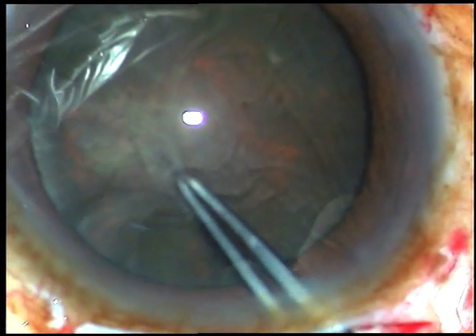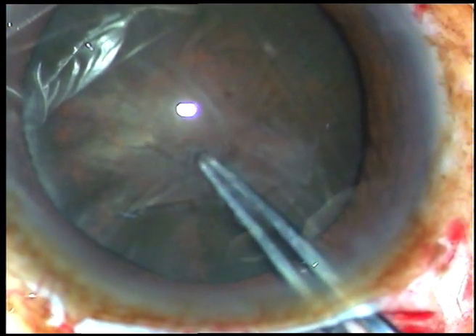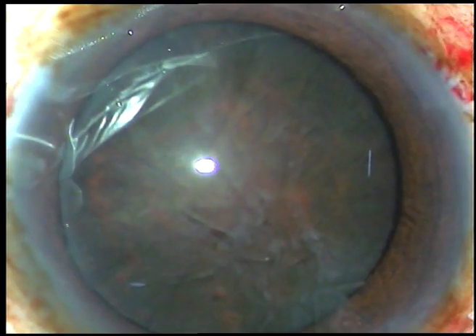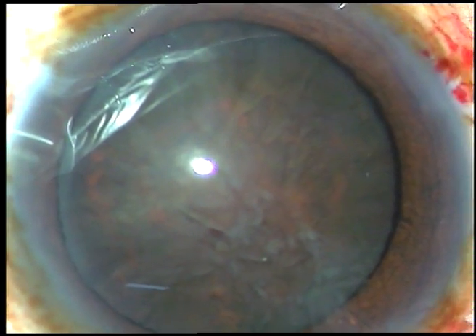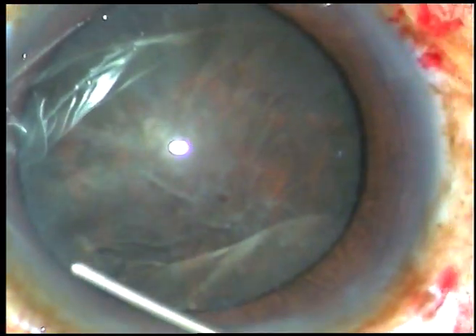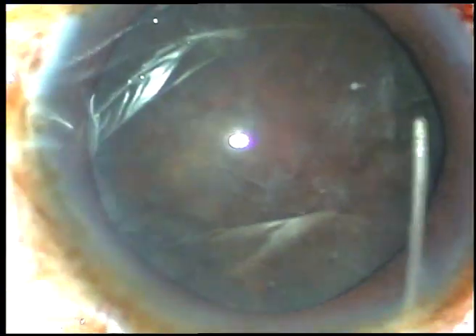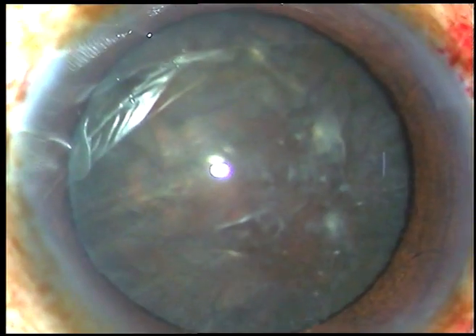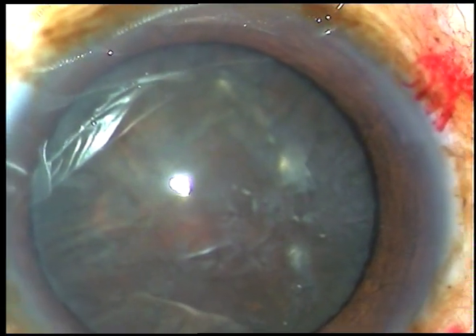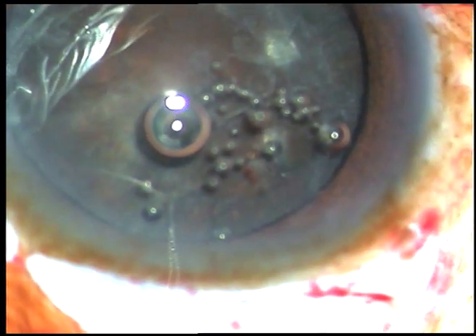If we make a large CCC, the prolapse of the nucleus becomes easier. Now hydrodissection is to be done. Ringer's lactate is injected first, just underneath the anterior capsular rim. The nucleus is tapped and the nucleus is mobilised. Viscoelastic substance is injected again.